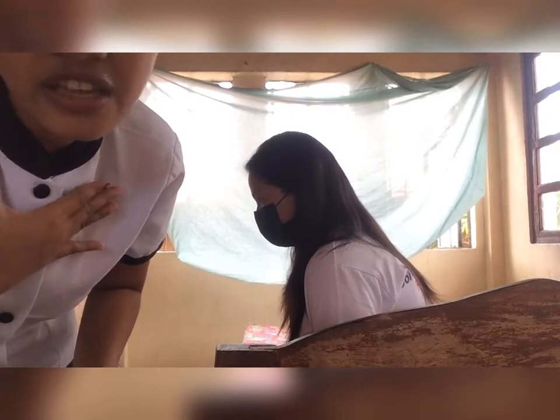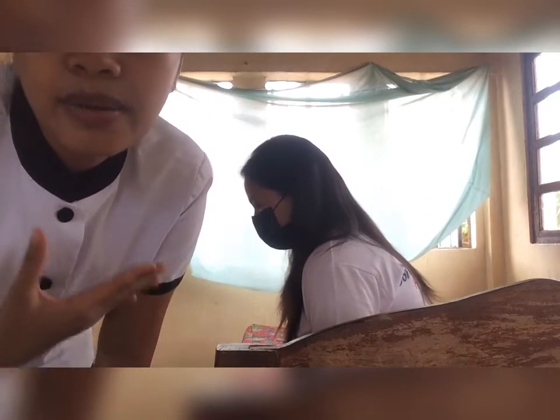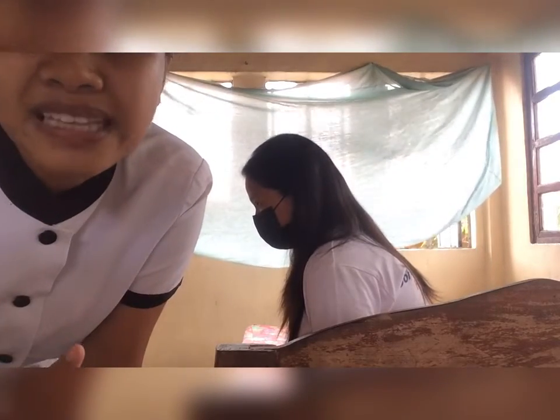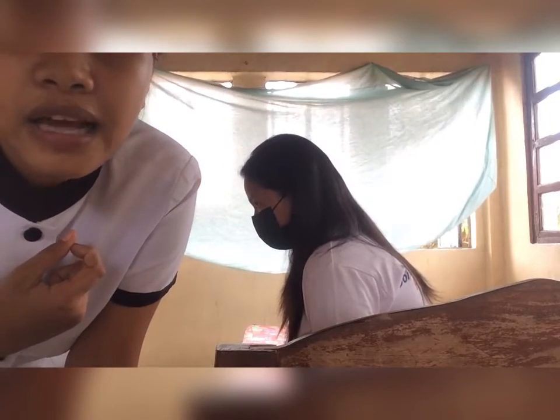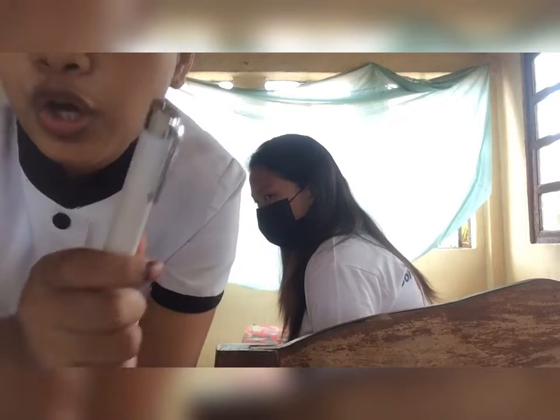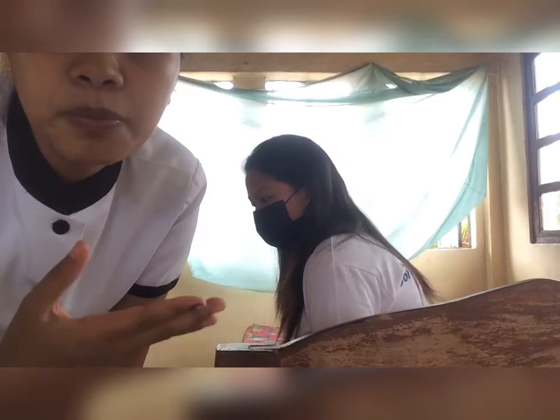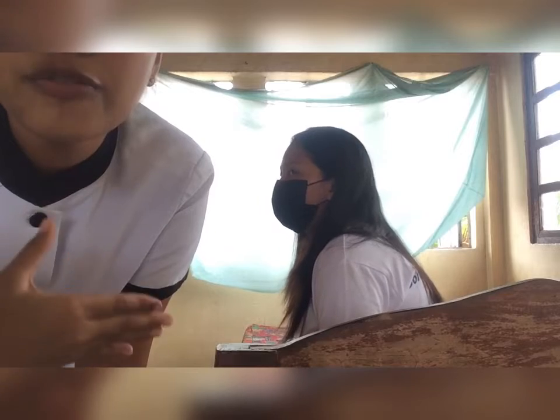So as a nurse, I am going to assess the child for the ear examination. But before the assessment, assemble the equipment and supplies such as an otoscope and tuning fork, and then do hand washing to deter the spread of microorganisms. And then introduce yourself, identify the patient, and explain the procedure.